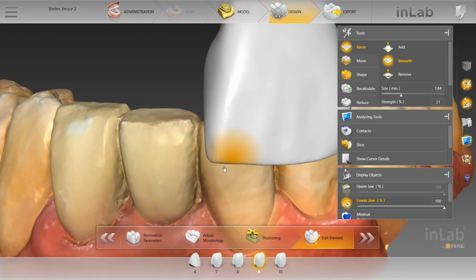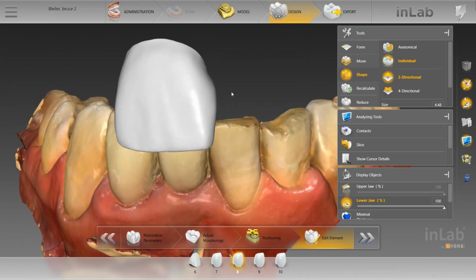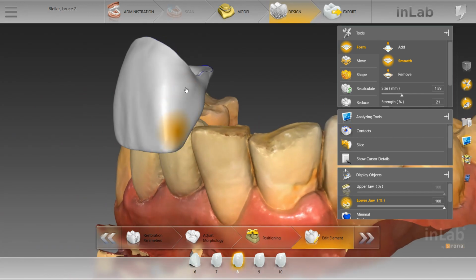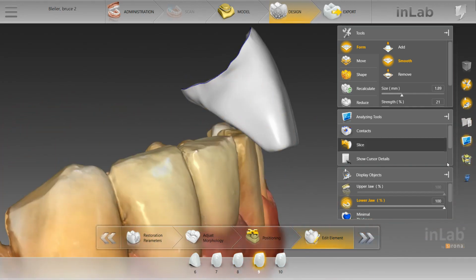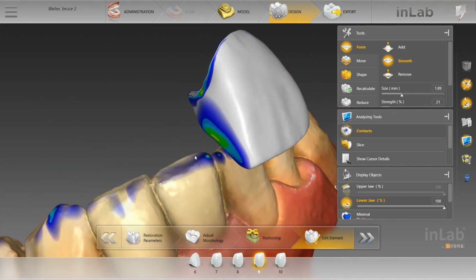And while we're here, we could also use the midline of the lower centrals. But for now, that's okay. We're gonna make further adjustments after we look at this, and you could see that this isn't perpendicular either. So we're gonna grab that and bring that over. And then we'll take the smooth tool where we've got these bumps and whatnot. We're going to smooth those out. Now we could start turning it and making adjustments that way. Take number 9, smooth it out. And then if you pull up the contacts, we're already a lot better. All of this would have been red before.